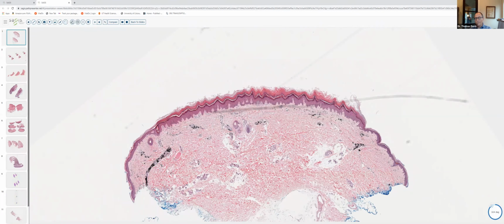This particular hyperplastic epithelial structure is not a follicle. If you take a look in the center, you can see a little duct here, and this is hyperplasia deriving from acrosyringeal epithelium, and it's the body's attempt to form a transepidermal elimination channel to get rid of this gel foam. Usually, of course, it's resorbed by the time you would get transepidermal elimination. And then we've got fibrosing granulation tissue. This was undoubtedly a punch biopsy site.